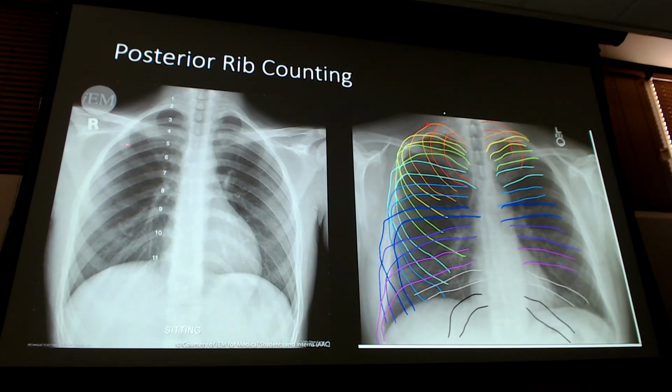Okay, so I know that's 2. So then trace that up. So then that's 2. And then 3, 4, 5, 6, 7. So I use my anterior to get me to start off my posterior so I don't get confused on if this is 1 or 2 ribs up here. Because depending on the patient, those suckers can overlap by quite a bit.